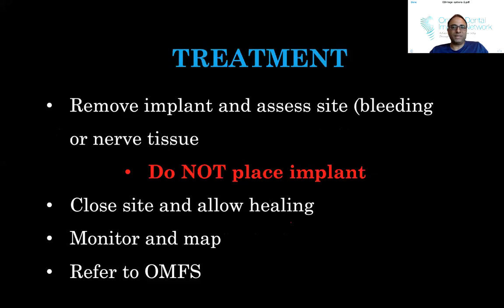Assess the site. If you get a lot of bleeding, ask me how I know, you probably hit something not good, and it could be the nerve. Or if you get nerve tissue on the end of your drill, again, ask me how I know. Don't place the implant. Close the site, allow it to heal, monitor, map it, all the things that they tell you to do, and then refer to the oral surgeon.